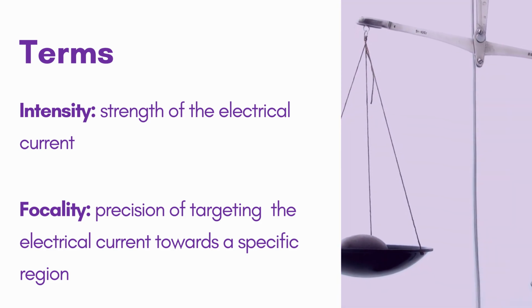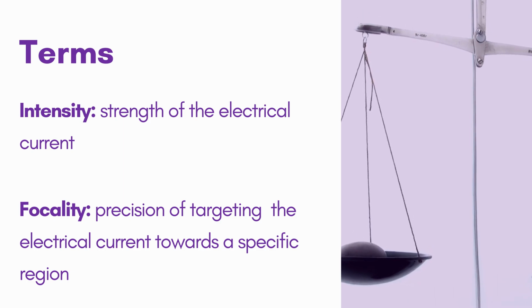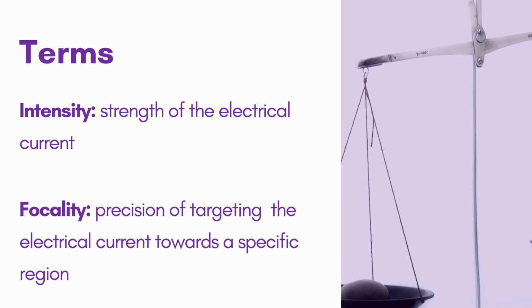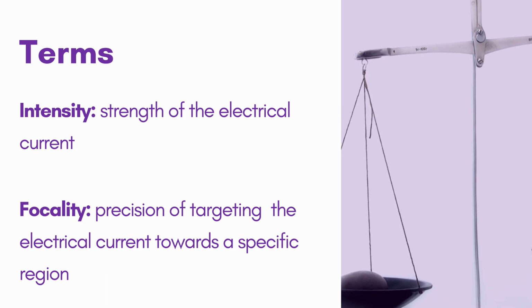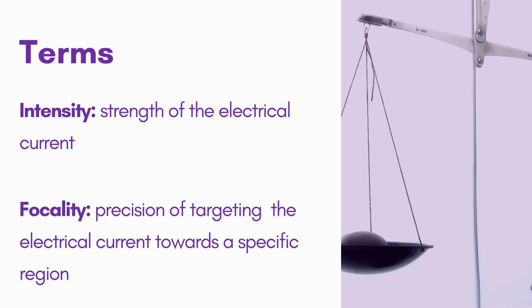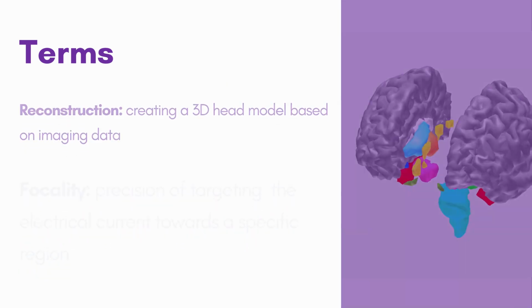Intensity and focality are closely related in the sense that they represent two key factors that need to be balanced during TES optimization. The intensity-focality trade-off is a balance between strength of the stimulation, the intensity, and precision of targeting, the focality. This trade-off is critical for achieving effective treatments while minimizing side effects.